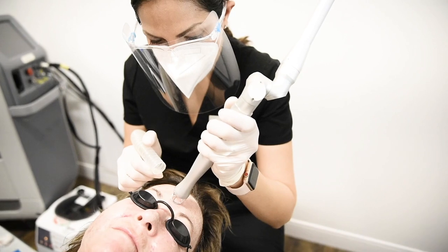If you're just doing the face, do the full face. If you're doing the lower neck, go ahead and do that as well. Remember, the lower neck does take a lot longer to heal, so you want to make sure you're really prepared for that longer healing time of the neck versus the face.